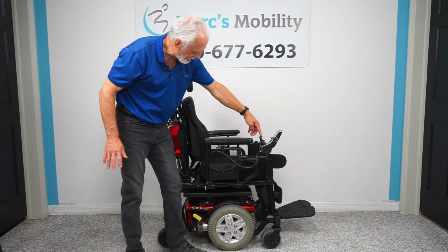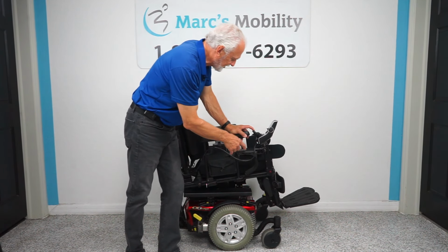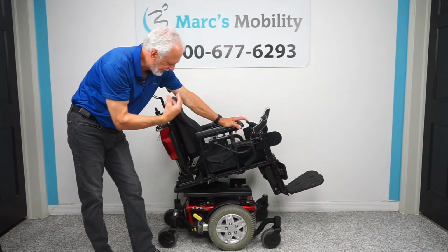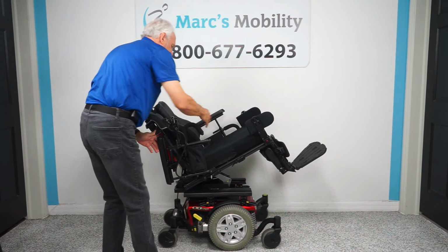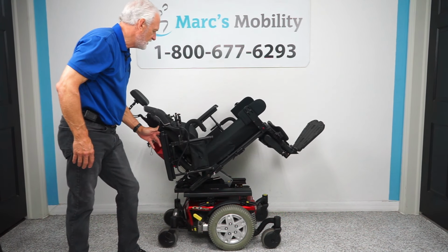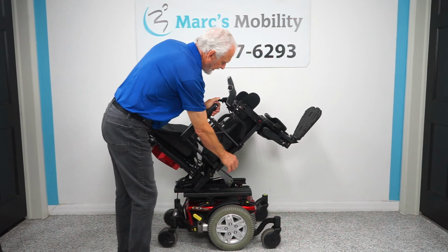All I have to do now is push the joystick back. You can see the tilt going back. Now electric tilt means your legs and your back are going to go backwards. The whole seat is tilting. This has a lot of medical benefit if you need to get pressure off your bottom, pressure off your back. There's a lot of medical benefit to that. Okay? And you can see how it's tilting. Just want to show you the arm up, also what it looked like.